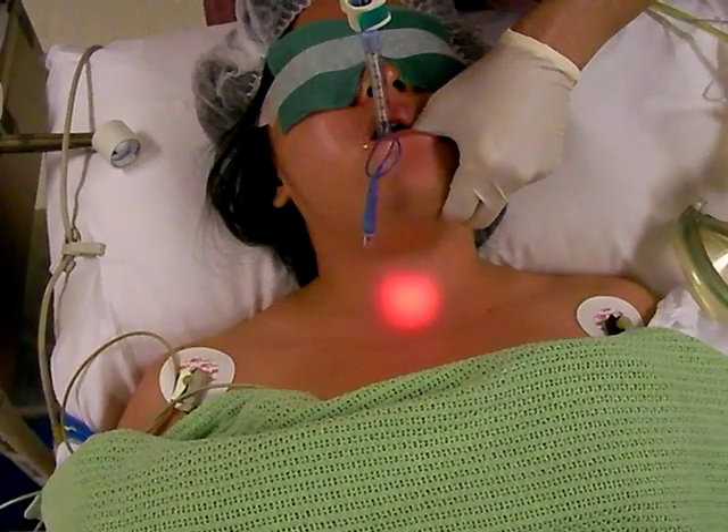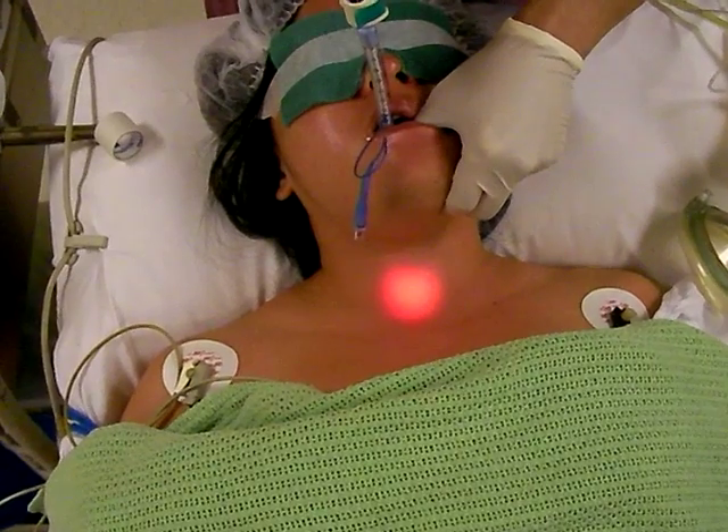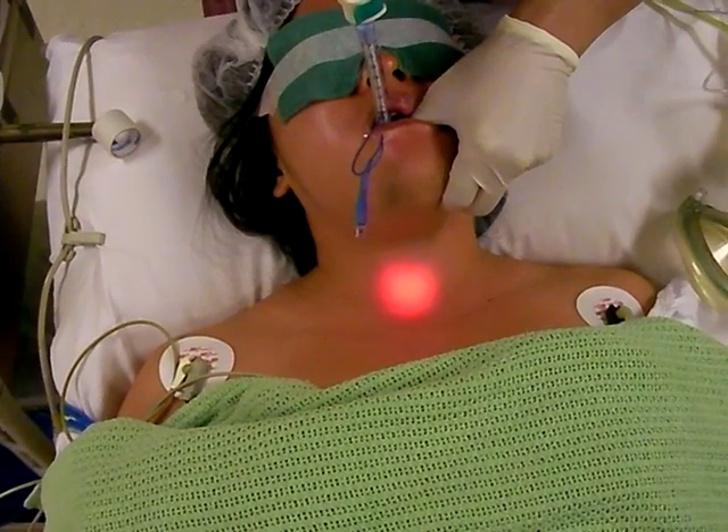Advance until the tip, or the glow, is below the thyroid cartilage edge. That means you are now inside the patient's trachea.